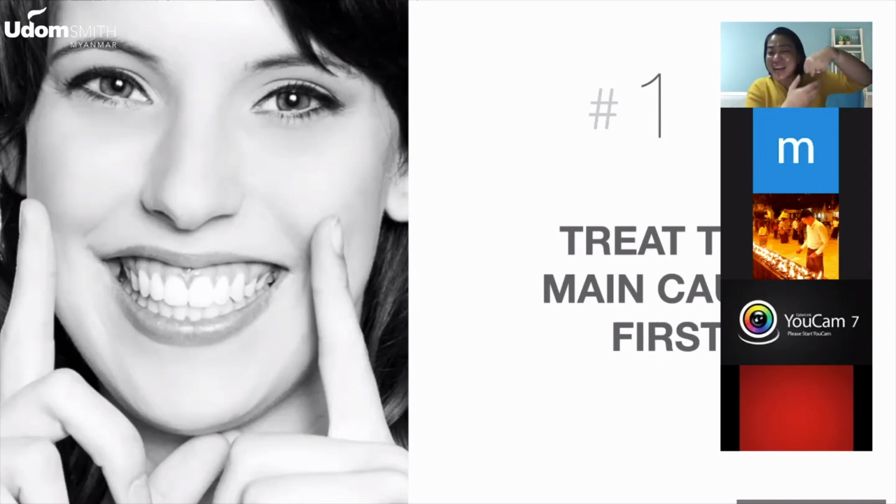If there is class 3, then remove the class 3 first. Then you fill the cavity with composite. But if you want it to have a full look, then you place Edelweiss veneer. That you have to remember.